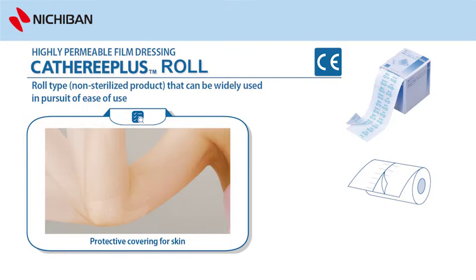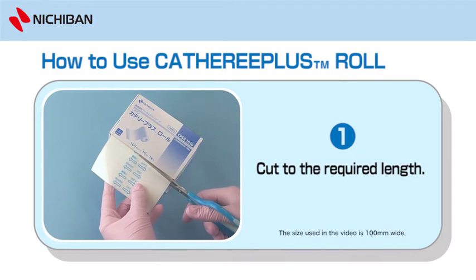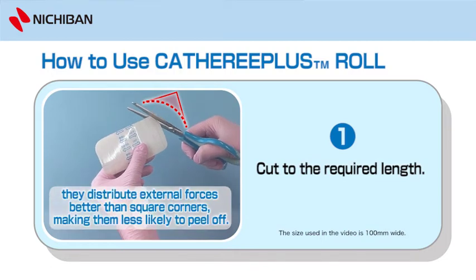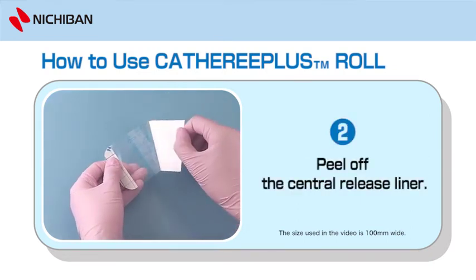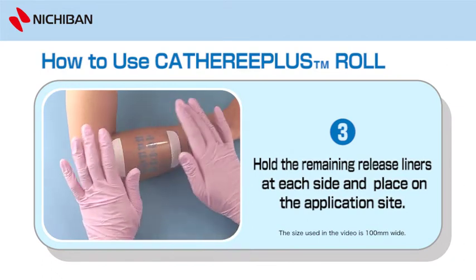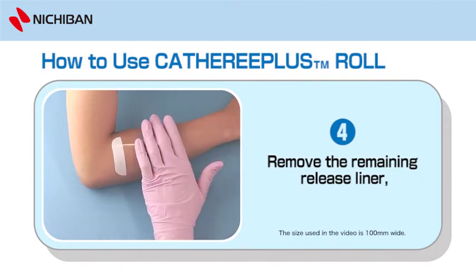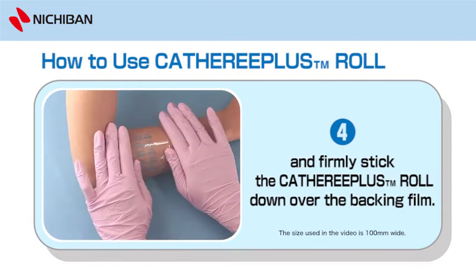To use Catharee Plus Roll: 1. Cut to the required length. By snipping the tape corners so that they are rounded, they distribute external forces better than square corners, making them less likely to peel off. 2. Peel off the central release liner. 3. Hold the remaining release liners at each side and place on the application site. 4. Remove the remaining release liner and firmly stick the Catharee Plus Roll down over the backing film.